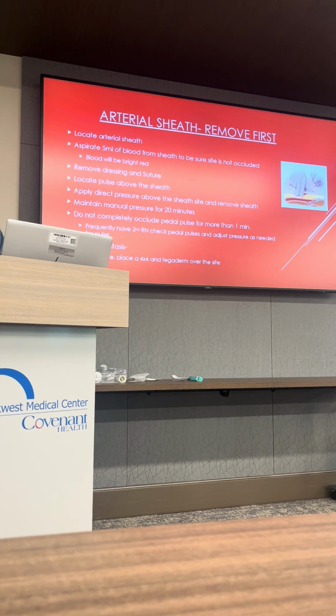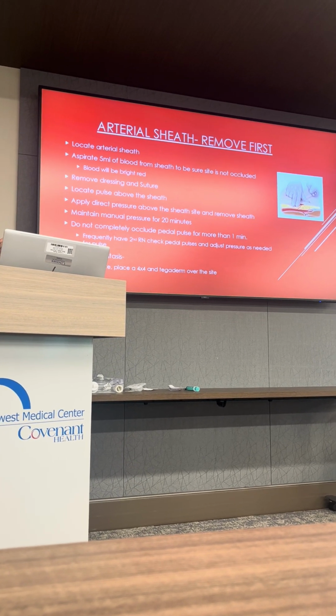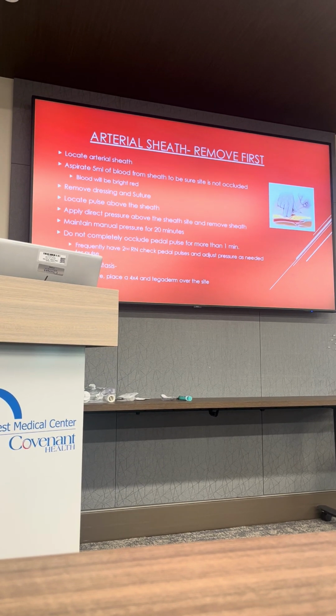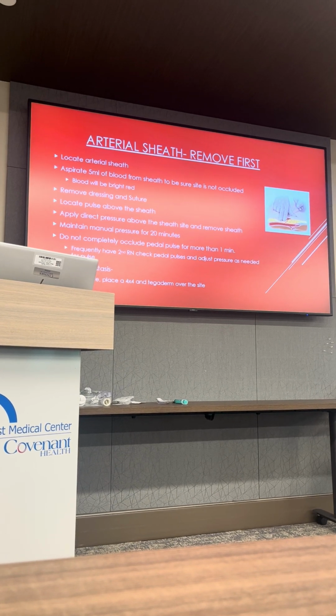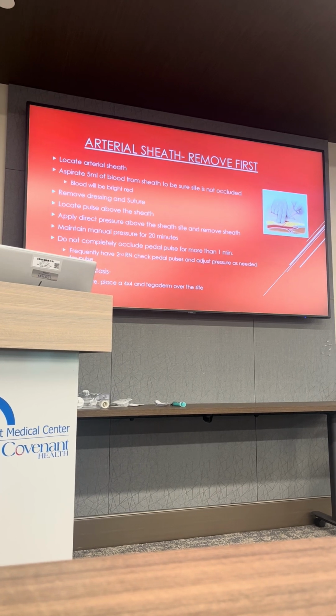Yeah, it obviously varies. It seems arterial, right? Well, if they have TR, it'll be most top. Yeah, so it's, but I don't know. I remember when I was in training, I would first look at whichever one in the groin, the lateral one, is the arterial sheath. But sometimes they're on top of each other, and you're like, yeah.